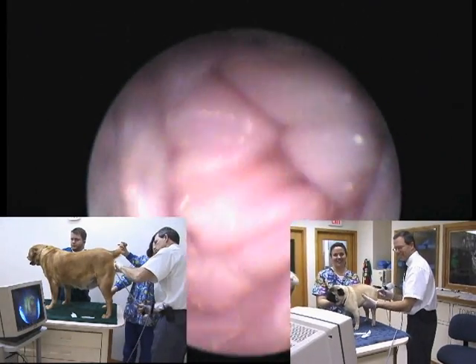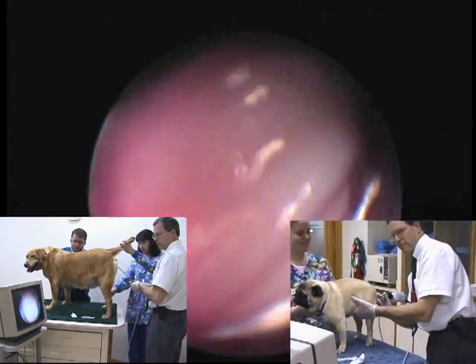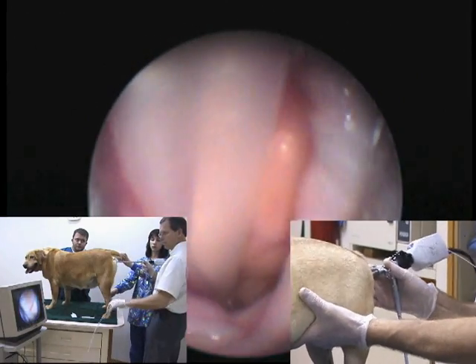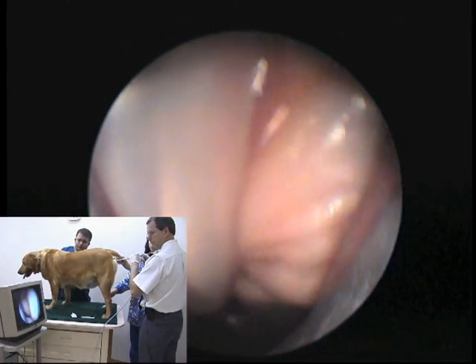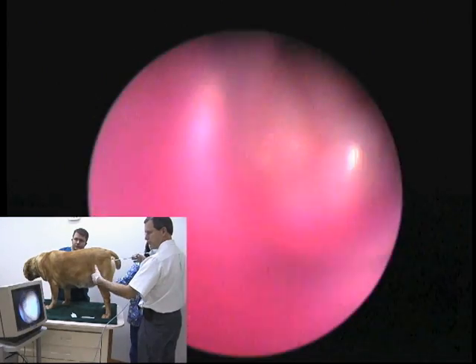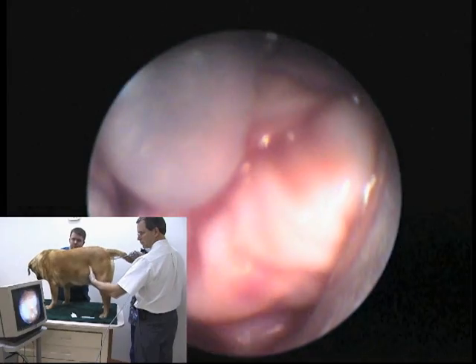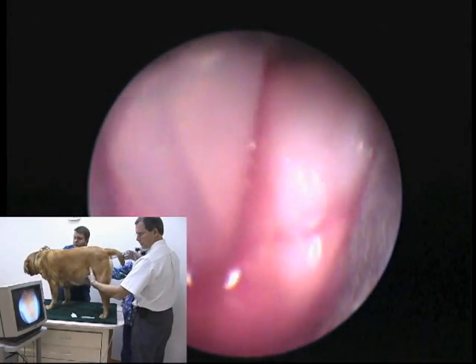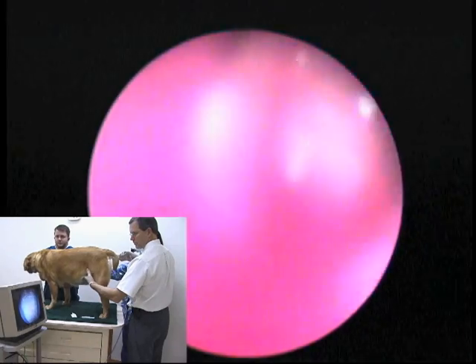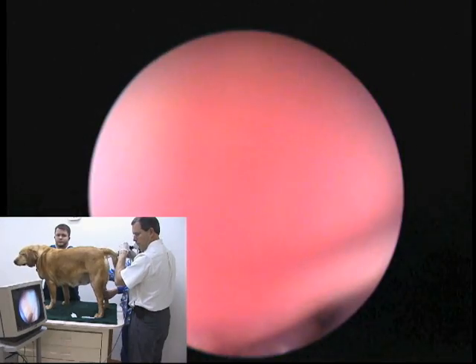We use a little bit of sterile KY on the scope, being careful not to let it touch the opening of the catheter or the catheter itself. We then advance the scope into the vagina by first putting the scope upside down as we go up over the pelvis, making sure we're not going into the urethra. As we advance in, we look at the folds — it's a good time to do a vaginoscopy on the way in, assessing for pillars, strictures, and any other problems in the vagina.